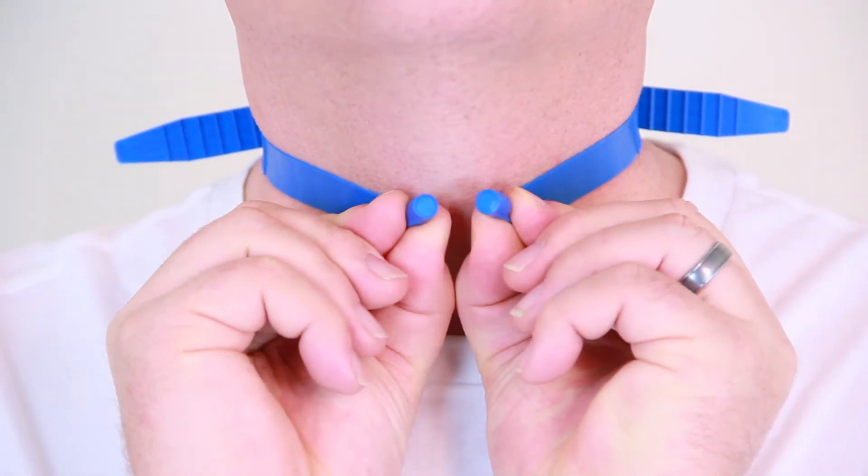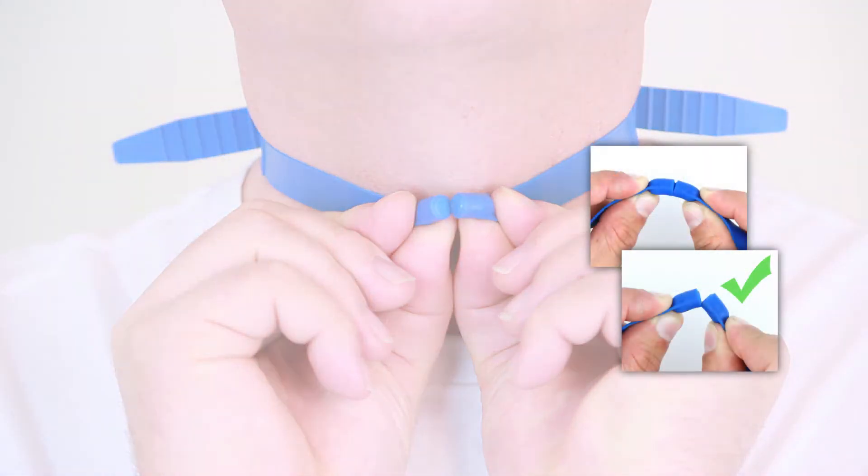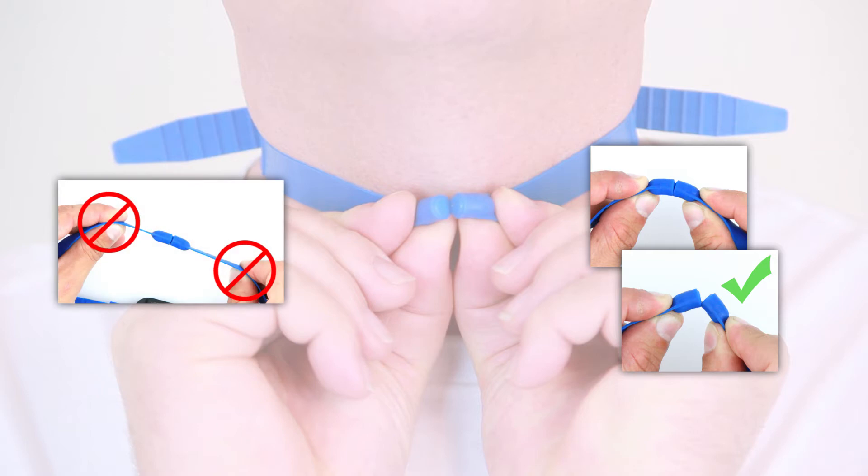To remove the Night Shift, when unclasping the strap, grasp each of the two magnets and bend them apart at a 90 degree angle, similar to snapping a stick. Avoid pulling the two magnets apart as this may cause the strap to break.